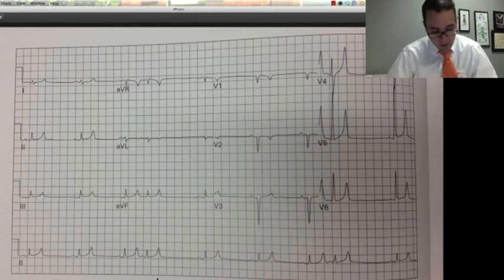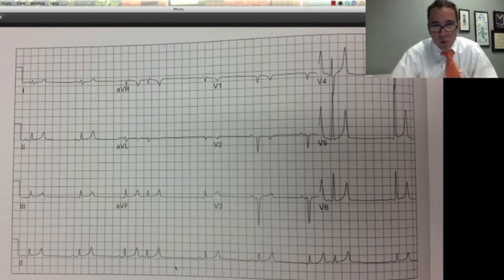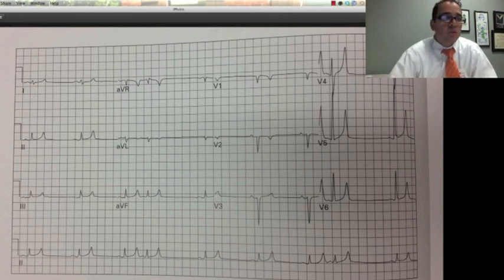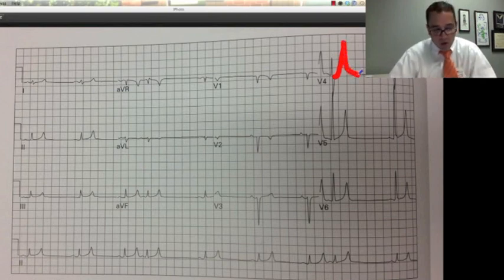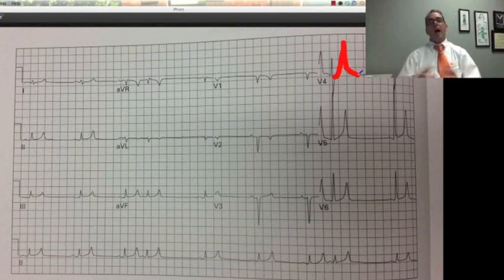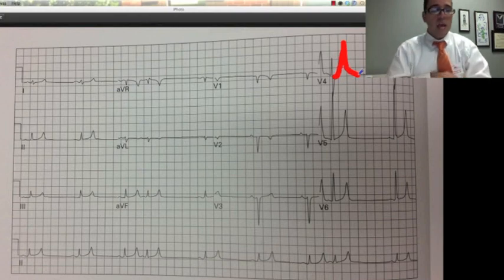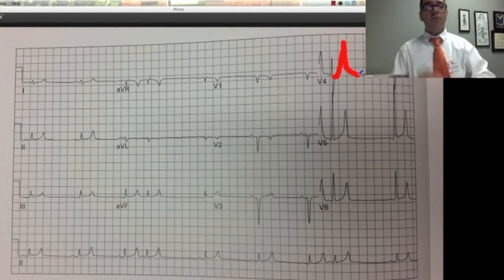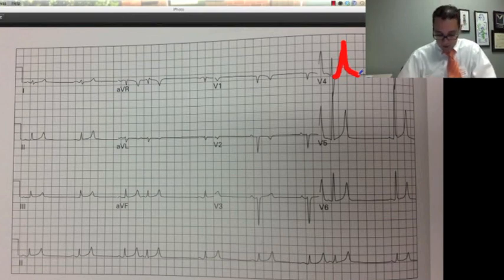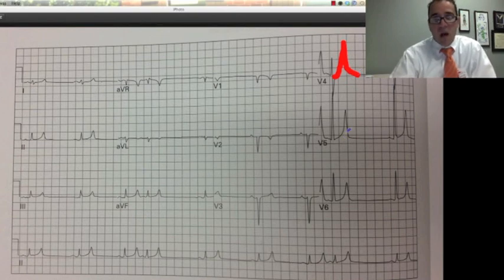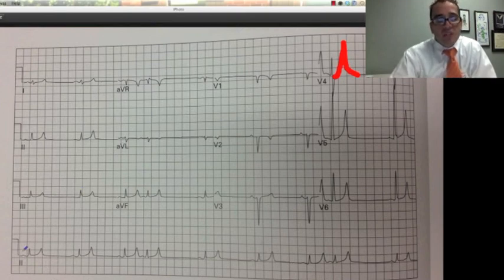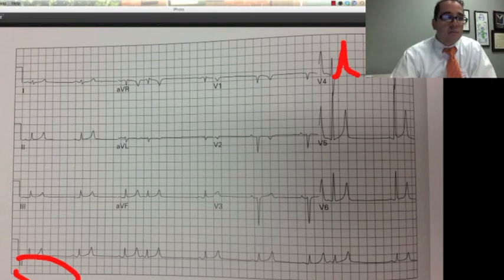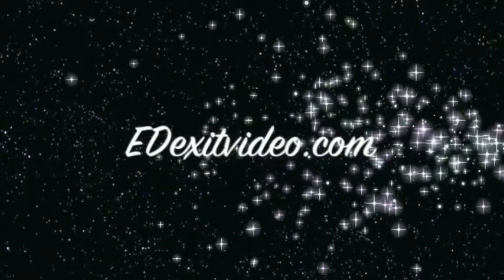This is sinus bradycardia — it's low. It's got some extra beats with a compensatory pause, so that's a PAC. But focus on this T wave — look at that T wave, it's a monster T wave. We can call these hyperkalemic T waves. Hyperkalemia is not the only thing that gives you hyper-acute T waves; ACS and coronary syndromes and ischemia can do that too. But in this particular case it's hyperkalemia. This patient had a very elevated potassium. We know the difference because it's symmetric and sharp-pointed — that's how we know it's hyperkalemia versus other causes. This is a young person with weakness and lightheadedness.